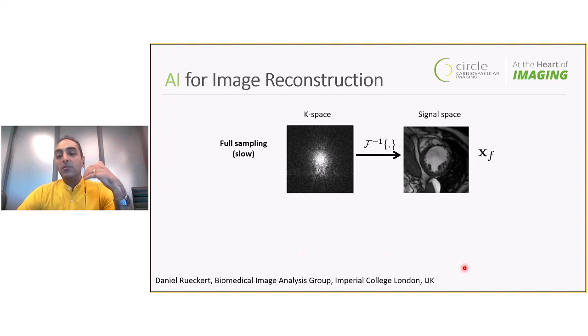To understand how deep learning can help with MR image reconstruction, we need to know how MR images are actually being acquired. So common imaging techniques, similar to digital photography, always have a source of energy. For digital photography, it's the sun. But another example is CT. Its source is X-ray, which is also an electromagnetic wave with a frequency that just happens to be larger than the visible light. Then, in addition to this light source, we typically have an object that we want to image and a screen or a sensor that is capturing reflections or refractions from the source of energy that bounce off this object.